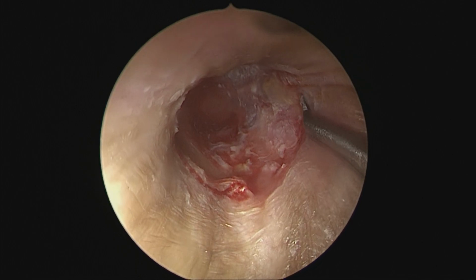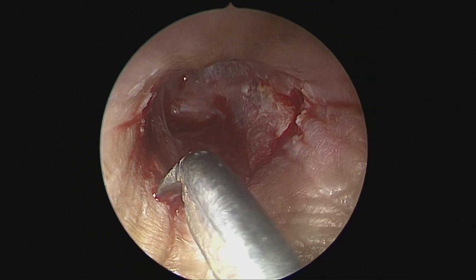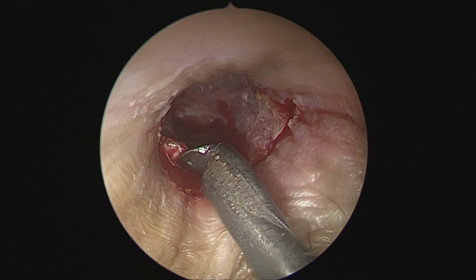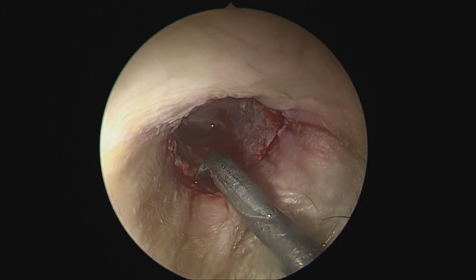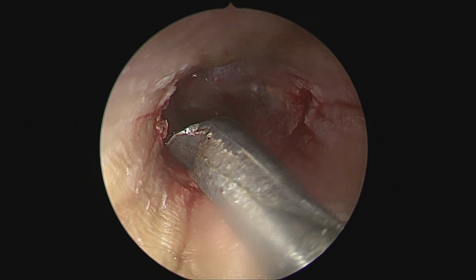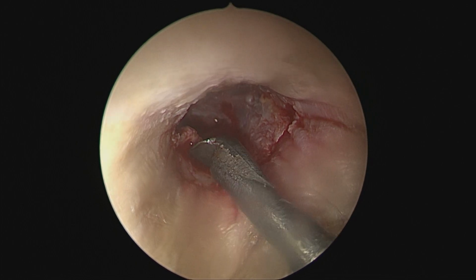An appropriate local anesthesia is very important in endoscopic ear surgery, because otherwise even a minimal amount of bleeding would soak our endoscopes and compromise vision. And now we use an endoscope-specific instrument, that is a suction elevator, to gradually elevate the canal skin from the bone.